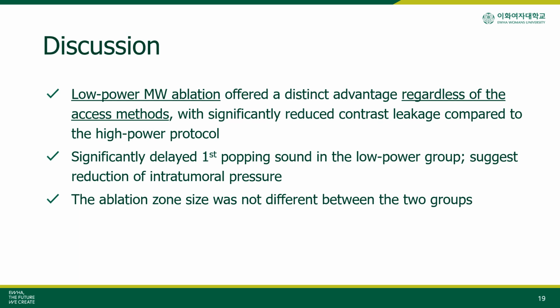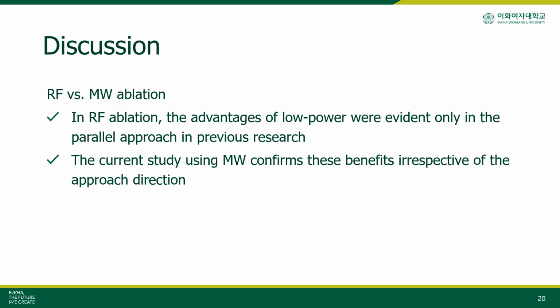In this study, we present the results obtained from the ex vivo subcapsular tumor mimic models. Fewer contrast leaks were observed in the low power group than in the high power group in both the parallel and perpendicular approaches. Additionally, the low power group exhibited a significantly delayed popping sound compared with the high power group. Notably, the size of the ablation zone did not differ significantly between the groups.